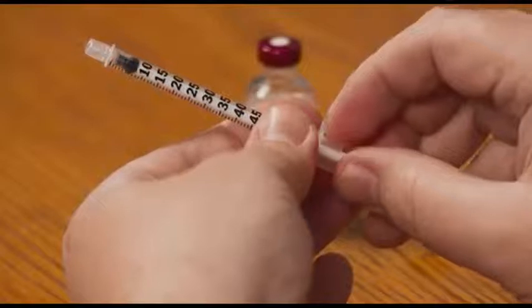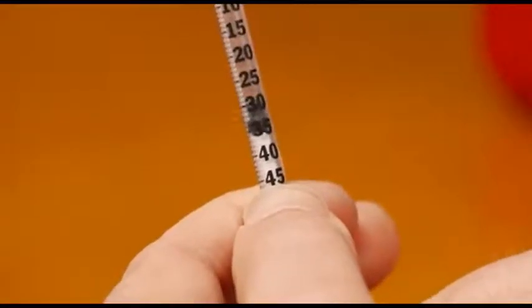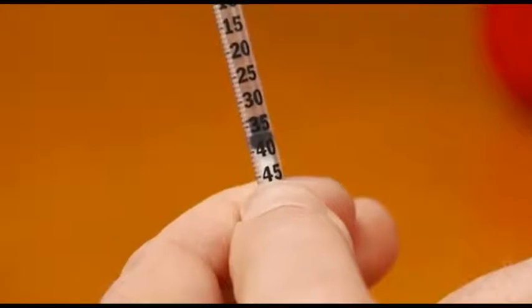To do this, simply pull the plunger until the end of the rubber stopper closest to the needle goes past the 30-unit mark to the 4th small line. This is the 34-unit mark.